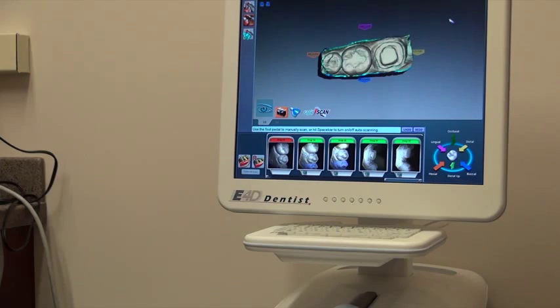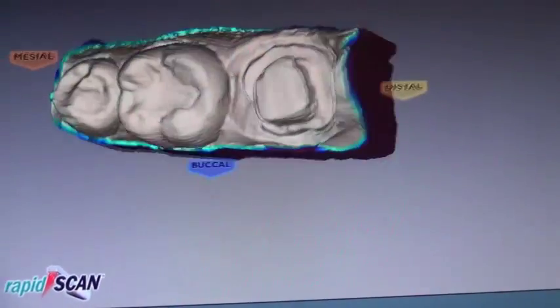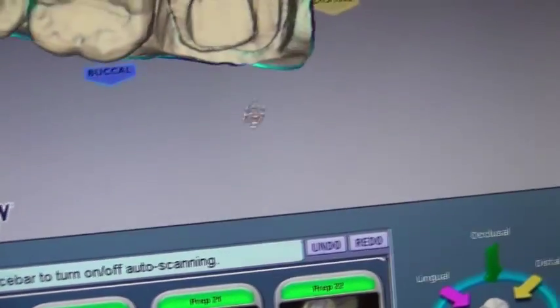We're left with something that looks about like that. Bring it in so you can see that a little bit better. There's our preparation — we can scan and look at it all the way around and visualize what we need to see. We can see the margins where I dished those out, and they look very nice.